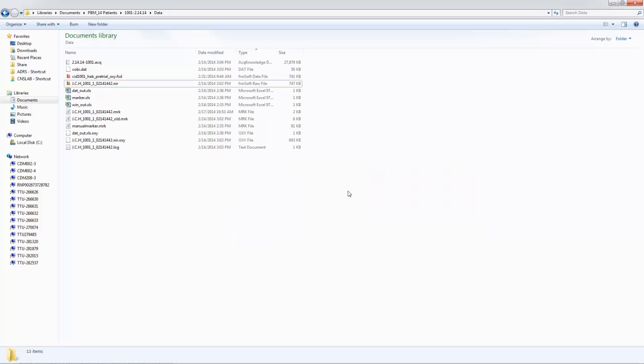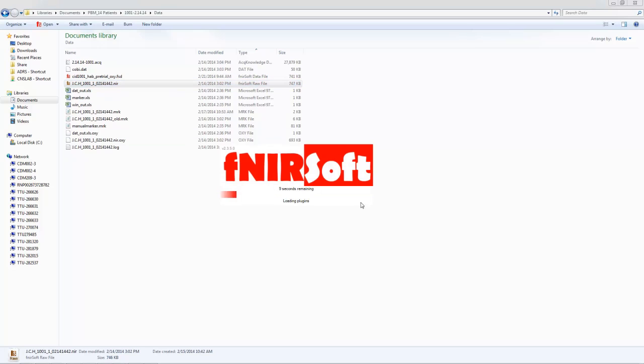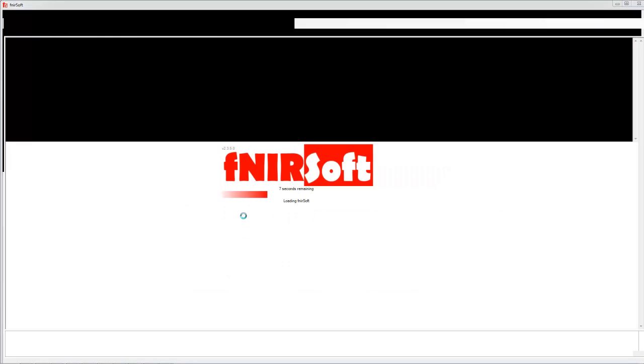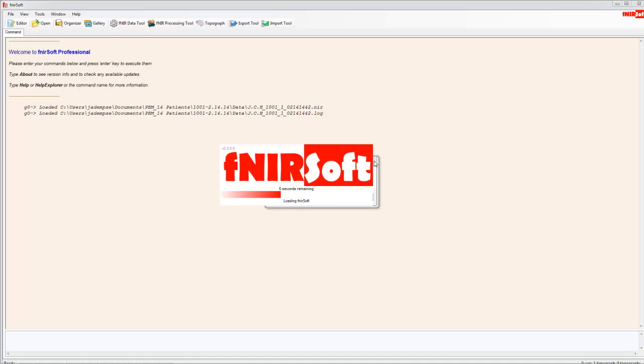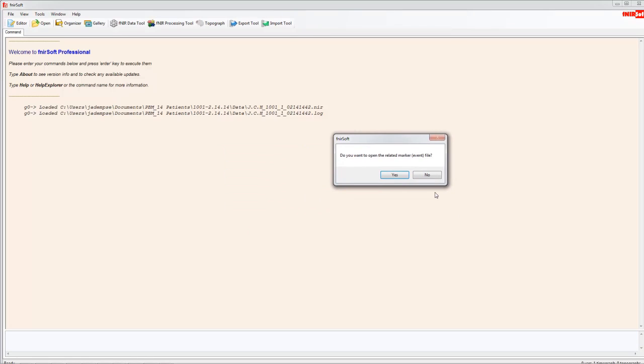So this video does not show the probe cleaning portion. Okay, so the first thing we're going to do is open up our NIR file and let fNIR soft load. It's going to immediately ask you if you want to open up the related marker event file, which we've already cleaned so that it only shows us when pictures start.